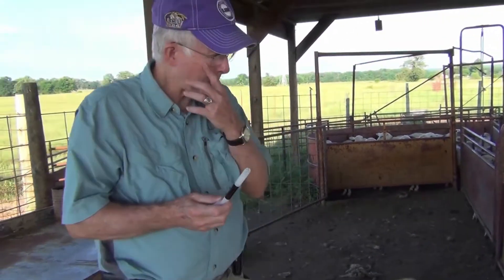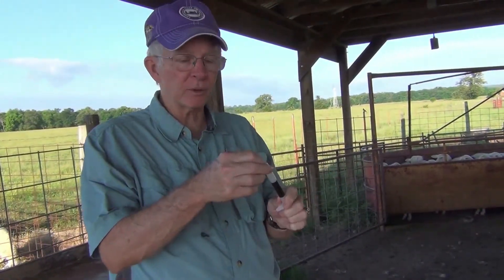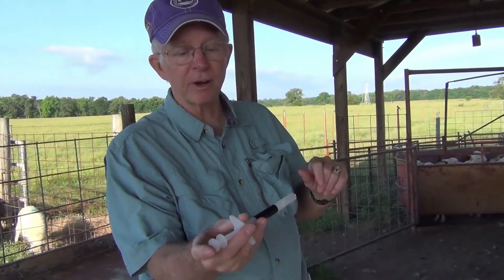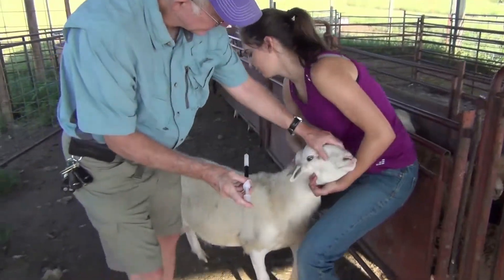The copper wire capsules are about big enough to fit in a standard bullseye pill gun. The little particle sits in here and the little prongs hold it in place. It's a plunger apparatus — you have the bolus in there and the plunger at the end, with your finger ready to go to administer the bolus.